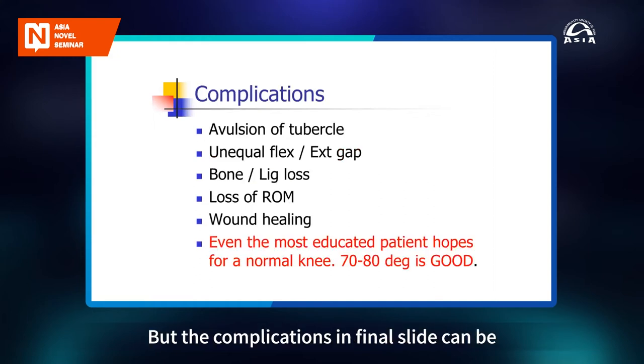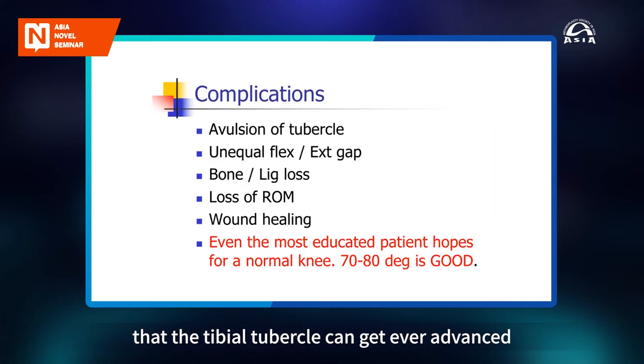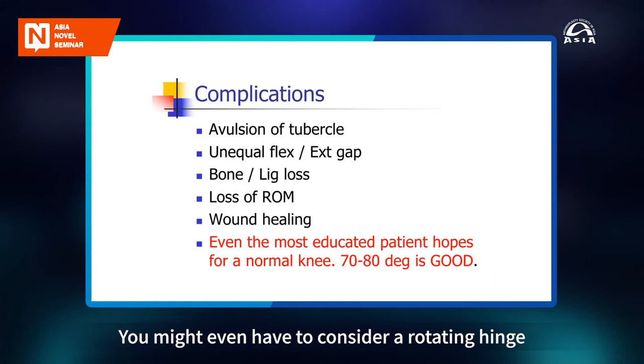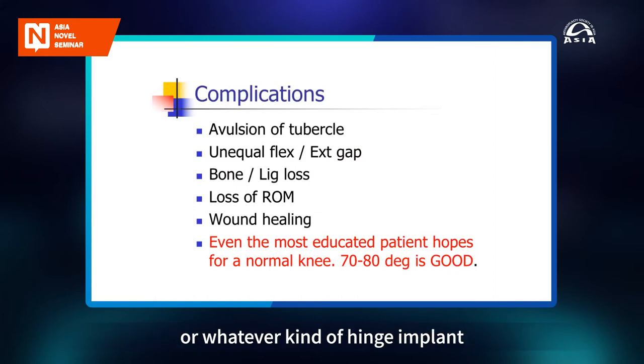But the complications, final slide, can be that the tibial tubercle can get avulsed. That's a difficult situation. You may get bad flexion gaps. If you are not able to control it at all, you might even have to consider a rotating hinge or whatever kind of a hinged implant. That's not a happy situation, but you have to be ready if you're not able to balance it.